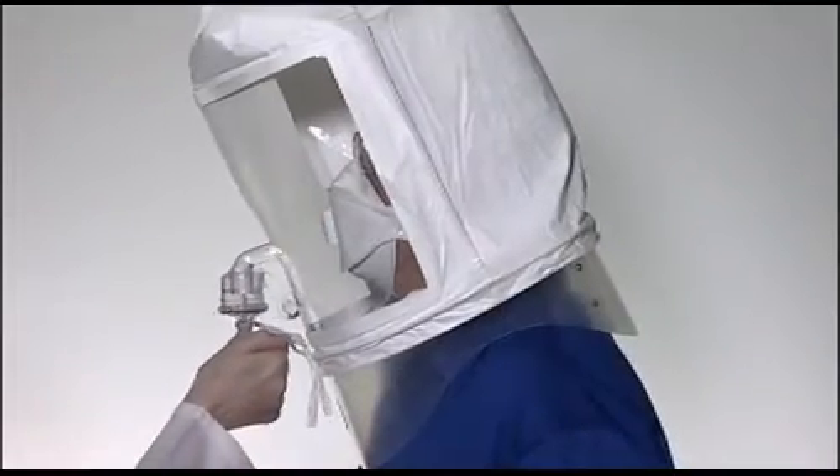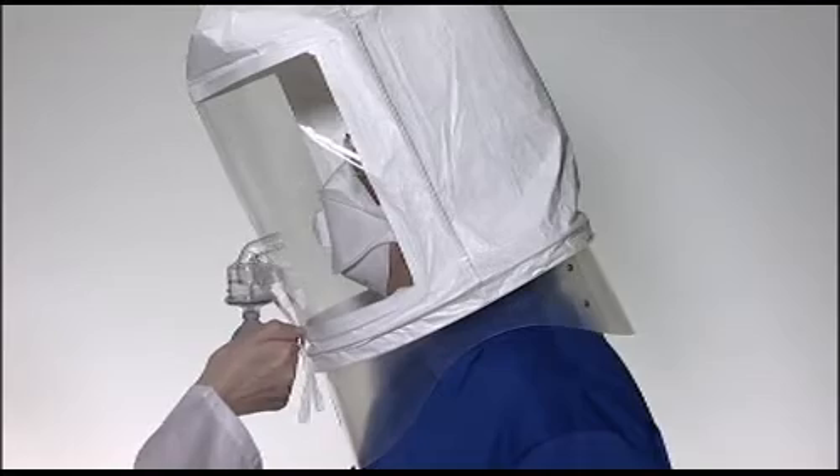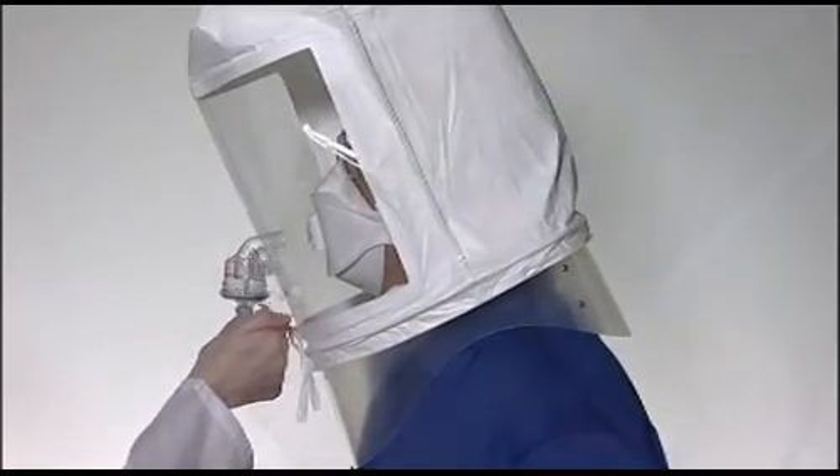The 3M Aura should be fit tested. This can be done with the 3M FT10 or FT30 fit test kits. Respirator users should be fit tested in accordance with national requirements.